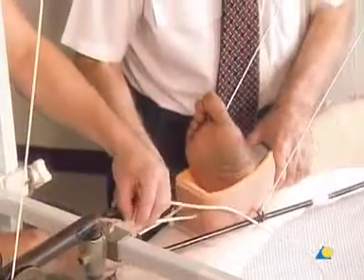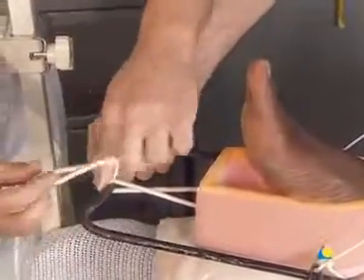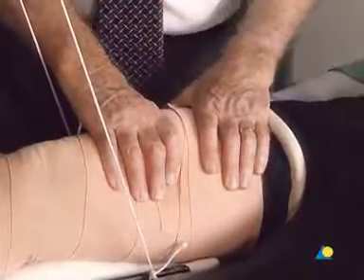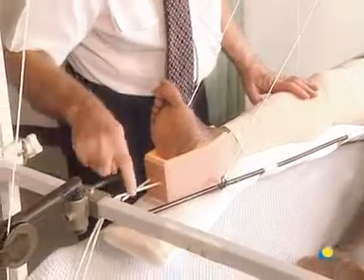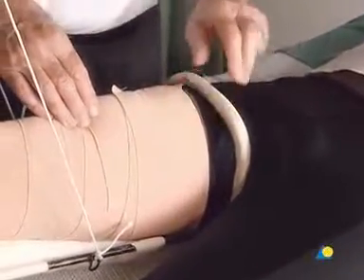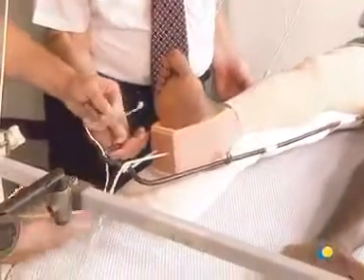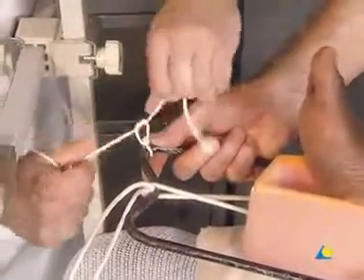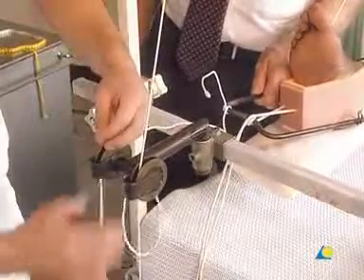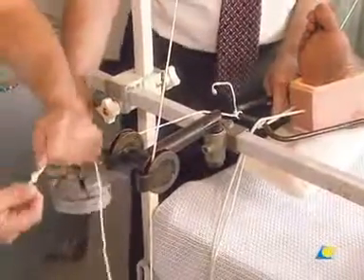Additional traction may be applied by re-tightening and knotting the cord at the distal end of the elastoplast. The hands are used to reduce the femoral fracture. It should be noted that tightening the distal end of the elastoplast forces the ring of the Thomas splint to be displaced proximally, possibly causing pressure sores at the groin. To prevent this proximal displacement, contratraction with weights is applied to the end of the Thomas splint. Eight kilograms are generally sufficient for an adult patient, with less weight used for a child.